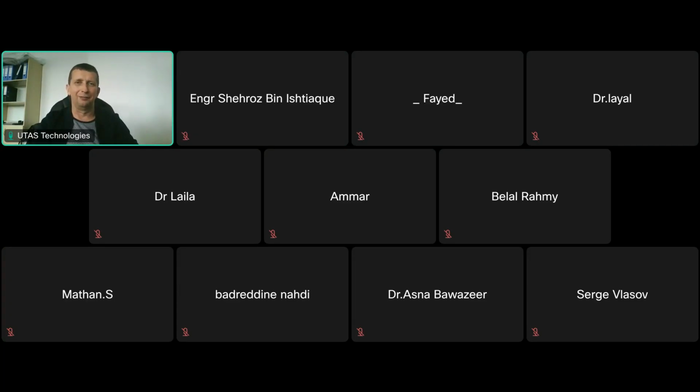So the ventilator is a tool in the hands of the doctor, and only the doctor can select the mode, because some modes could be even better for this patient. The doctor is responsible for mode selection, for setting selection, and other things.